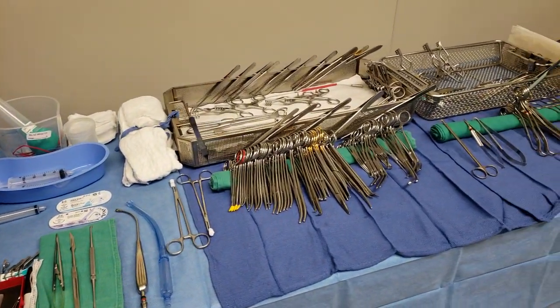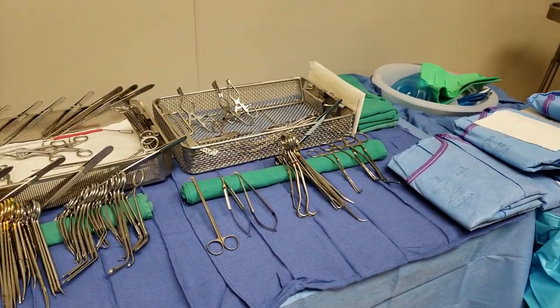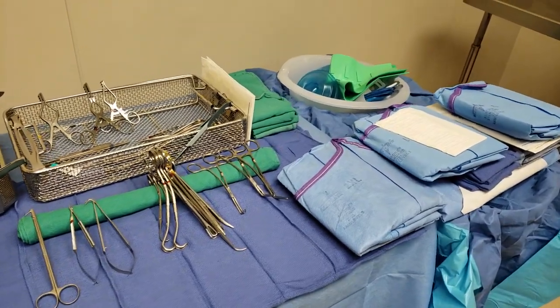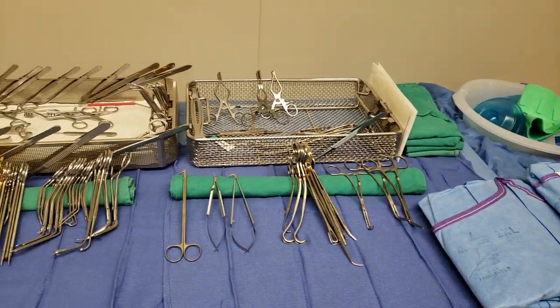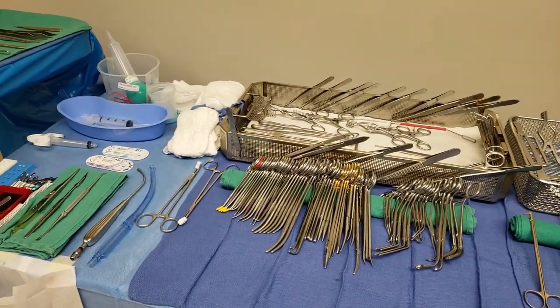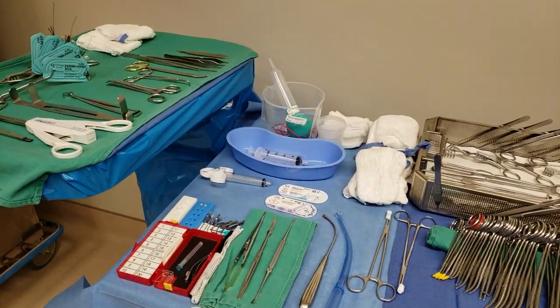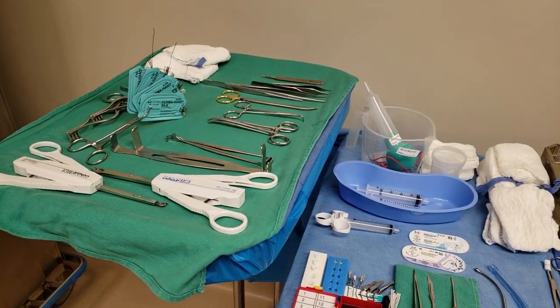Hey guys, just a really quick video for carotid endarterectomy. I've worked with this surgeon before but he hasn't been here in a while, so I kind of forgot the special stuff that he needs, and his preference card doesn't really say much. So I kind of just used my previous expertise and other surgeons' preferences and added on some things that are special for his case.